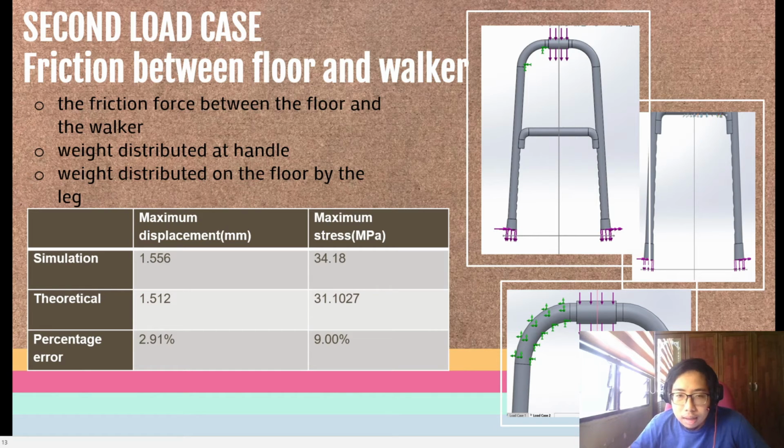As you can see, by using simulation, we get the maximum displacement of 1.556 mm and the maximum stress of 34.18 megapascal. But when we use the theoretical method, the maximum displacement is 1.512 mm and the maximum stress is 31.1027 megapascal. So the percentage error for the maximum displacement is 2.91% and for the maximum stress is 9%.